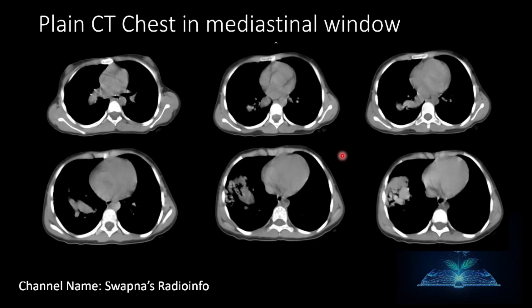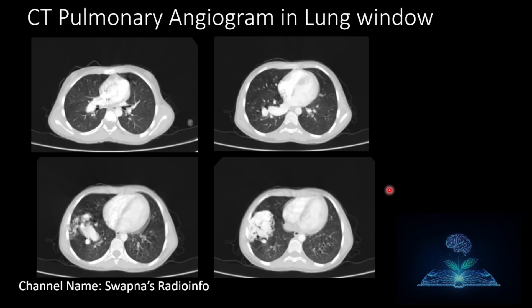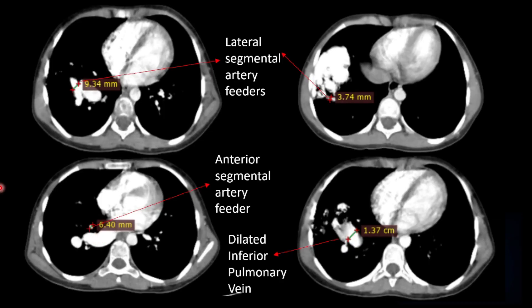CT pulmonary angiogram was then carried out. On plain CT chest in the mediastinal window, it shows heterogeneous soft tissue opacity in the right lower lobe. In the CT pulmonary angiogram lung window, you can see the lesion very clearly in the right lower lobe. On post-contrast imaging, you can see the intensely enhancing vascular nidus.